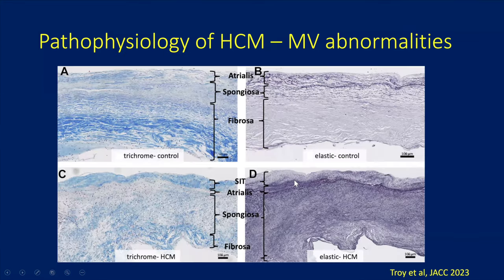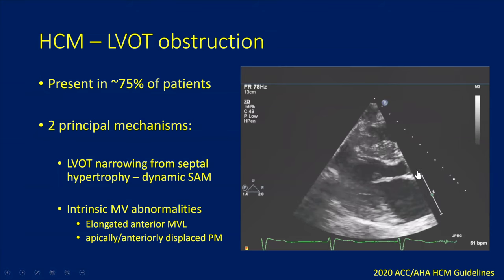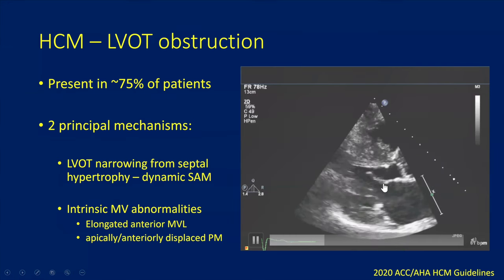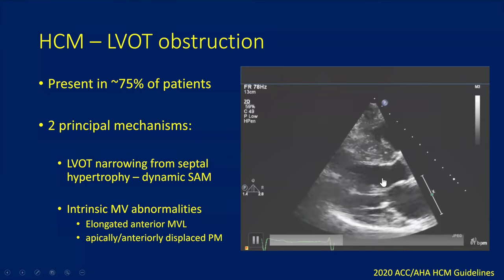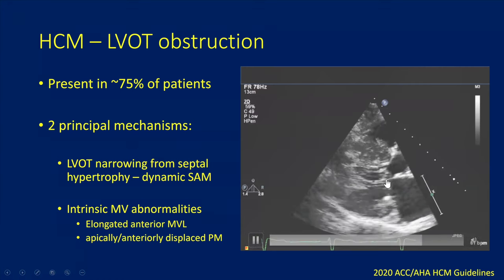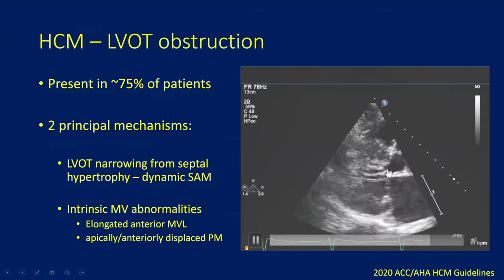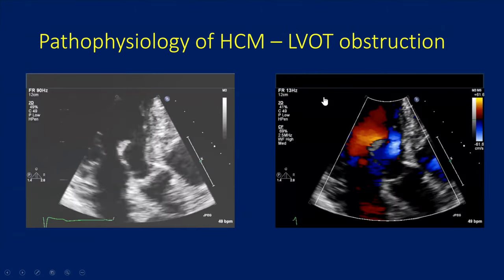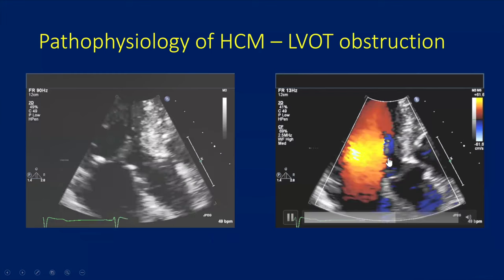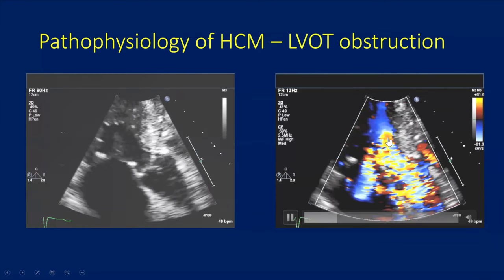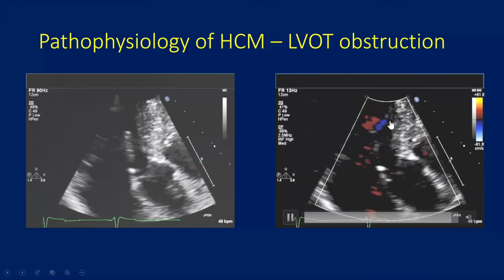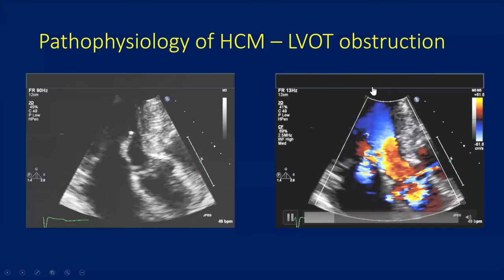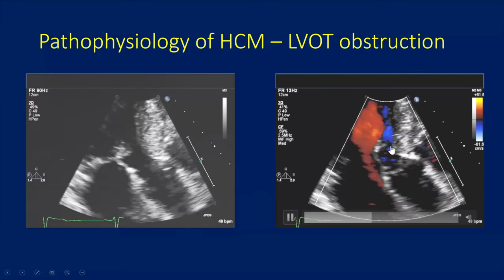So it's actually a combination of subvalvular apparatus abnormalities, intrinsic mitral valve abnormalities, and thickening of the septum that narrows the LVOT. All of these contribute to dynamic LVOT obstruction due to systolic anterior motion of the mitral valve. Here you can see the mitral valve moves into the septum in systole. Here is color Doppler — notice how there's flow acceleration at the level of the SAM. Sometimes when we look at color Doppler, there can also be a concurrent intra-cavity gradient, where flow acceleration starts much lower. But in this case it starts at the level of the obstruction.